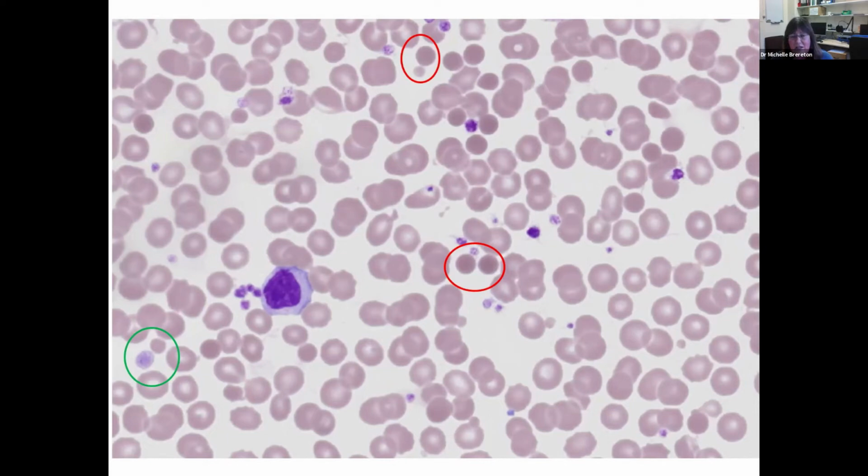And taking alongside the fact that there's a bit of clumping, it's important that when reviewing a film you would reflect on the platelet count in that blood film report, so that you would cover that. Obviously, the main impact is to get on the phone about the spherocytes, because this patient is going to need a blood transfusion.